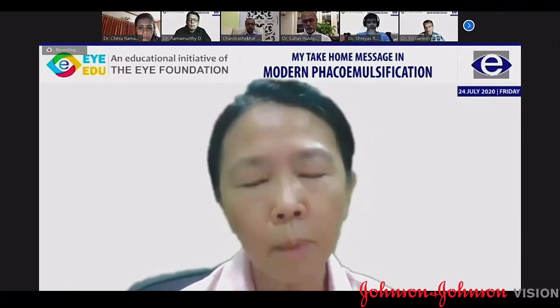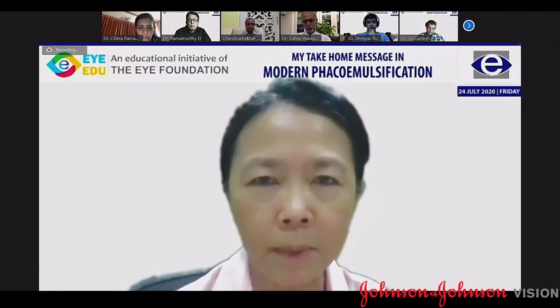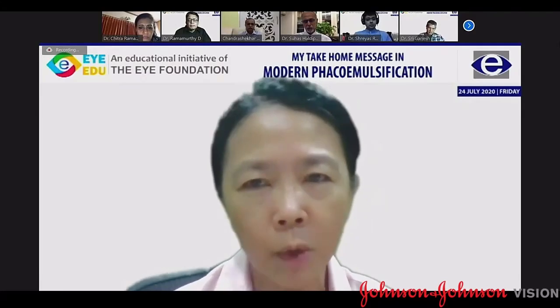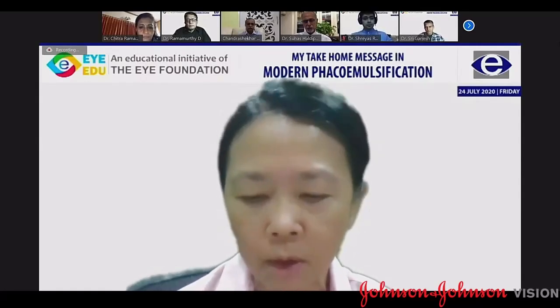And I think it's also important that you train your staff to know how to acquire this data properly, because if they are not positioning the head properly, for example, you may get readings that are really off, and when you go into the OR to adjust your astigmatism, you'll be actually adjusting to the wrong axis. So I think it's very important to do that.